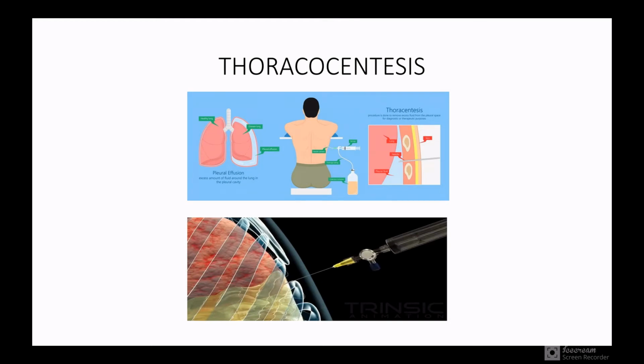So today I will be talking about a common procedure that is thoracocentesis. Everybody knows what thoracocentesis is, and it is a very common procedure in our hospital. You might know pleural effusion, that is excess fluid around the lung in the pleural cavity. Now talking about thoracocentesis, first we will talk about the procedure, what it is, and all the details regarding thoracocentesis. Before the introduction, let me show you a video.